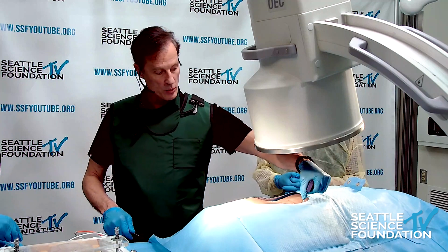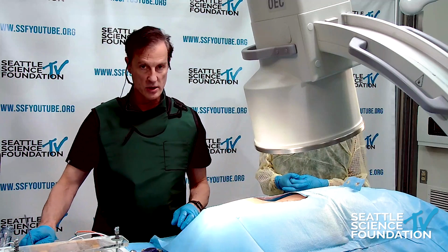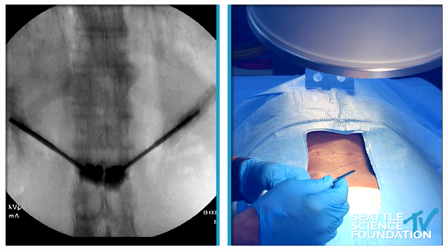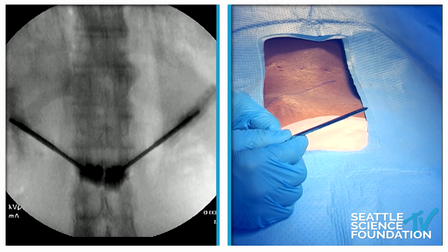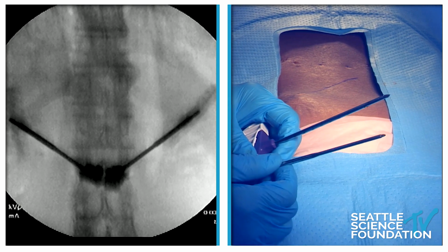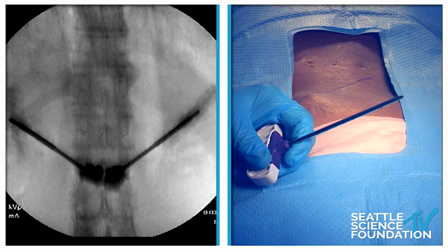One of the other things that we should go over really quickly is the Kyphon Assist. If I could have a camera to the tabletop. This is a diamond-tipped needle, a point that has multiple bevels, and it is very sharp on the end. This is a bibevel, with a bevel on the top and a bevel on the bottom.